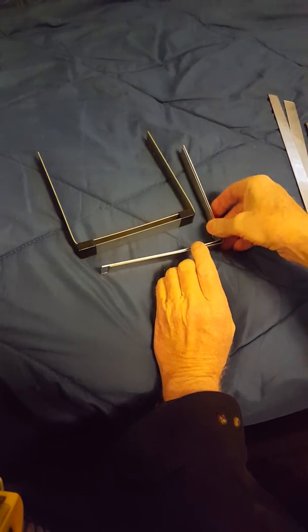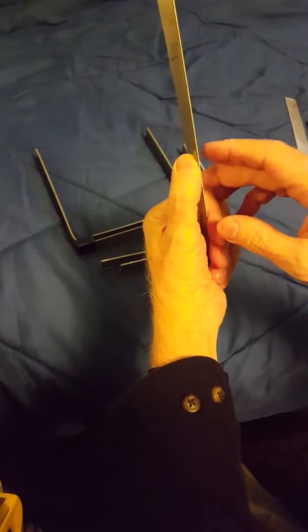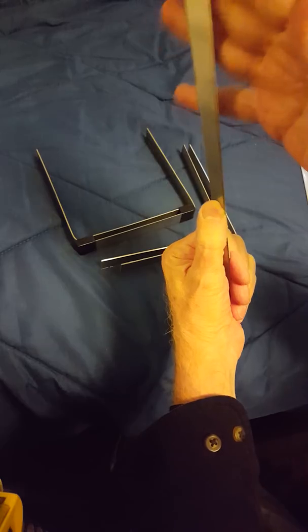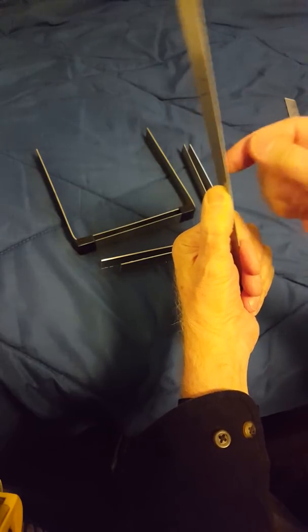Now, when you use this on an anvil, if you're not familiar with anvils, mark this at 6 inches, put it in the vise, and then put a little pressure on here. I would cushion your hand with something because it's going to vibrate, and then beat right here. A little pressure pulling that way, and then strike this with a hammer right here so you get a nice tight bend.